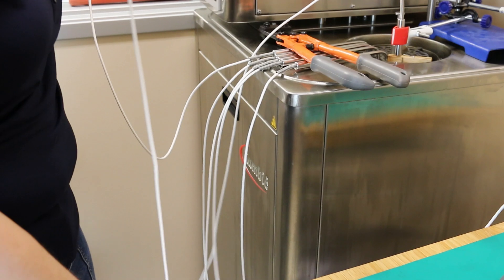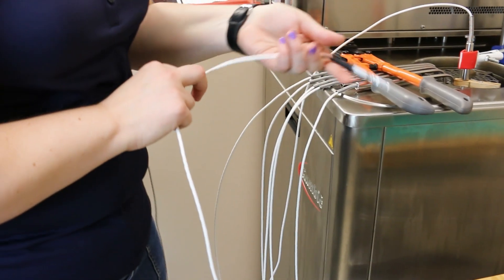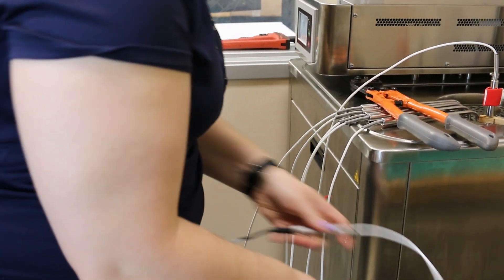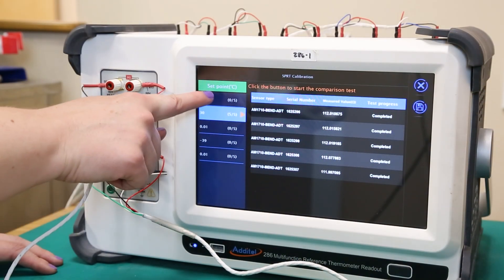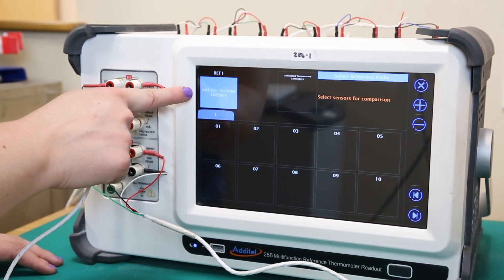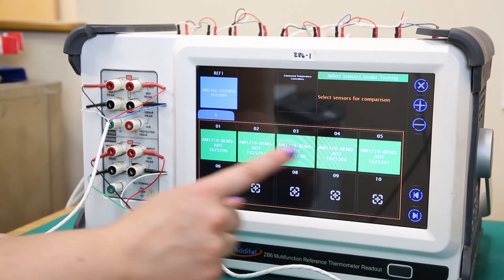Since these probes use quick connectors, we are able to easily disconnect and reconnect them without having to remove the four wire connections from the 286. On the 286 screen, select the first probe on the 160 degree calibration point, and follow the same steps as the previous calibration to run the automated measurement.